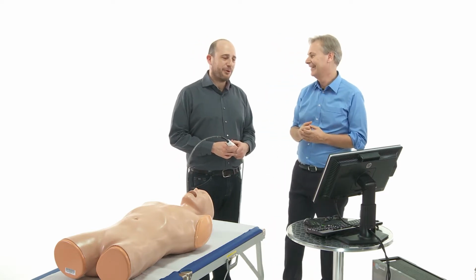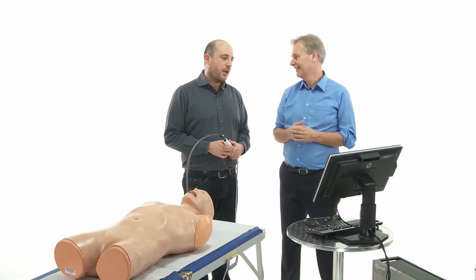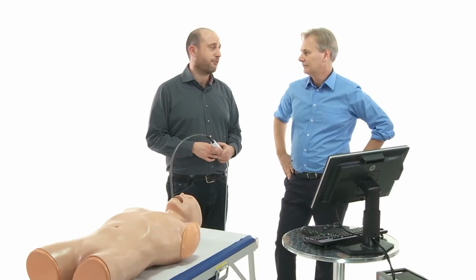We will get all the images from the transgastric view for the aortic valve. We can see the deep transgastric view, which is one of the most difficult to get in the transgastric section because most people lose their orientation during the image representation.